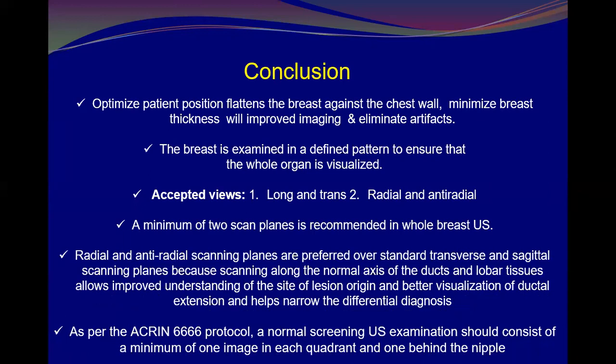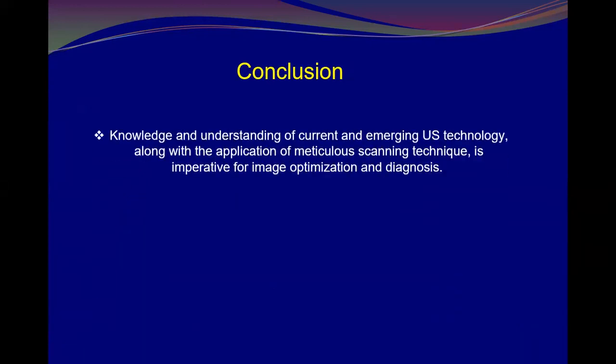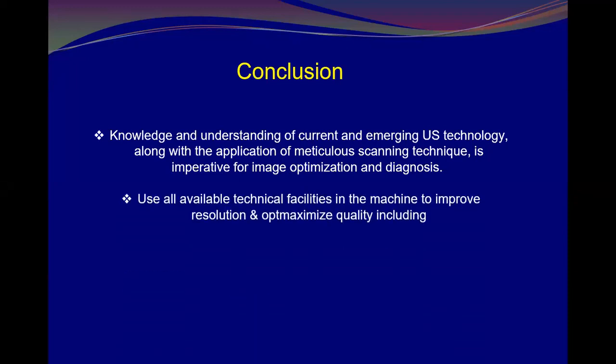And we mentioned that in case of screening ultrasound, it's recommended to have at least a single view for each quadrant and for the subareolar regions. Knowledge and understanding of current and emerging ultrasound technology, along with application of meticulous scanning technique, is imperative for image optimization and diagnosis.